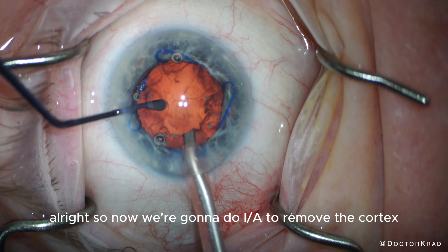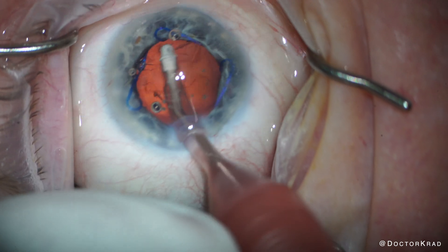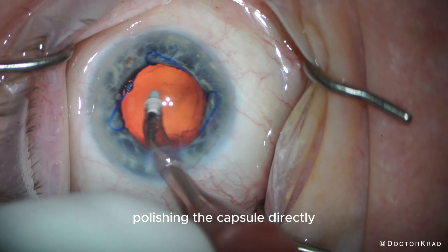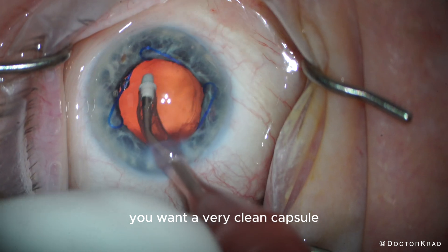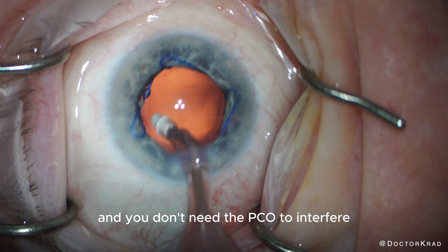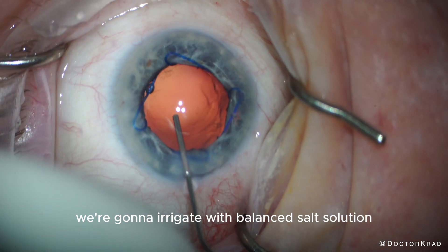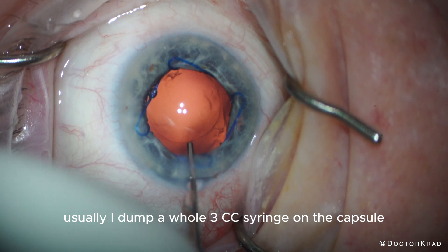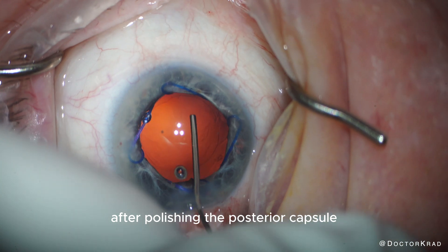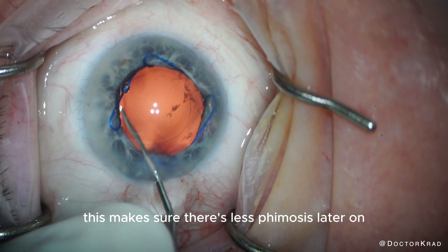So now we're going to do IA to remove the cortex — it comes out very easily. After cortical removal, we're going to do some polishing of the capsule directly. You want a very clean capsule because in the post-operative period, you want to know if the patient likes their lens implant and you don't need PCO to interfere. After polishing with the IA tip, we're going to irrigate with balanced salt solution — usually I dump a whole 3cc syringe on the capsule. After polishing the posterior capsule, we expand the bag and then polish the anterior capsule. This makes sure there's less phimosis later on.